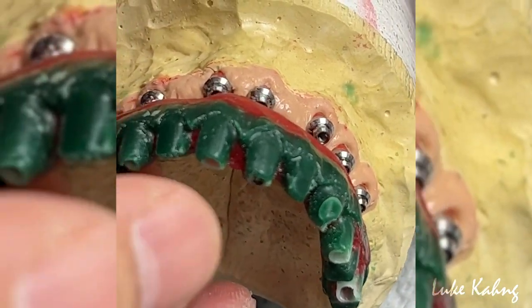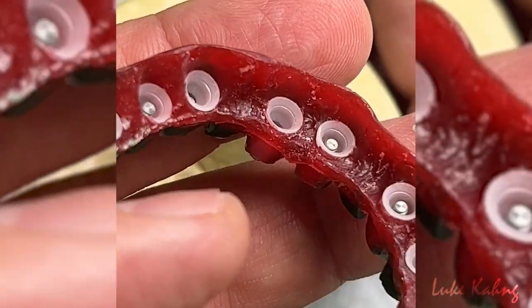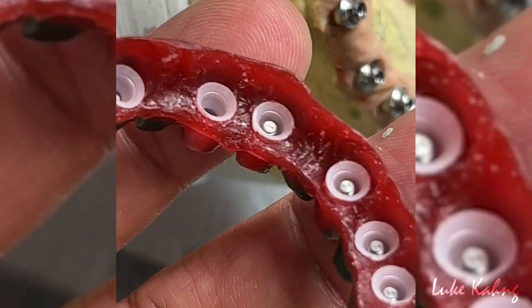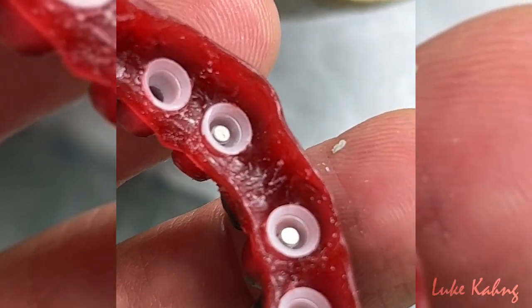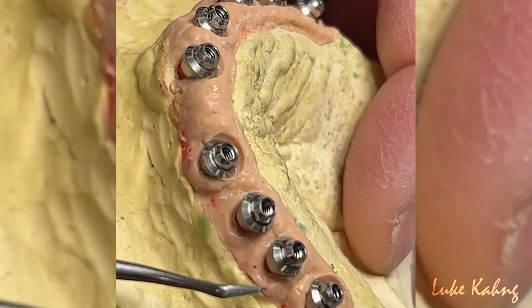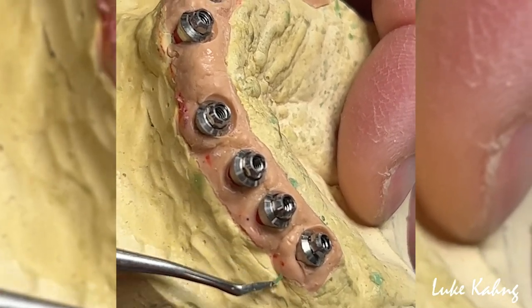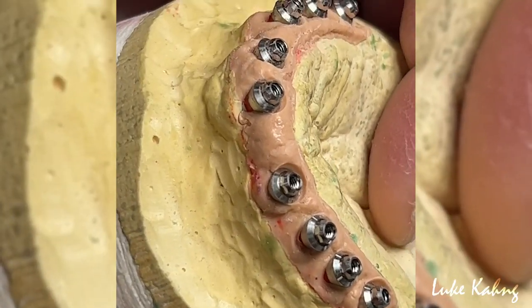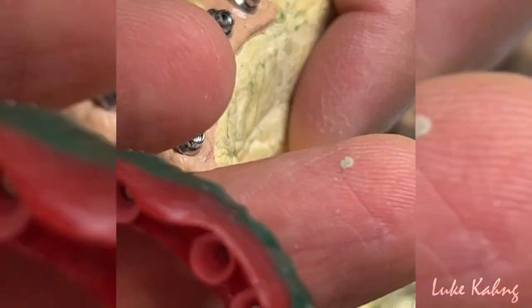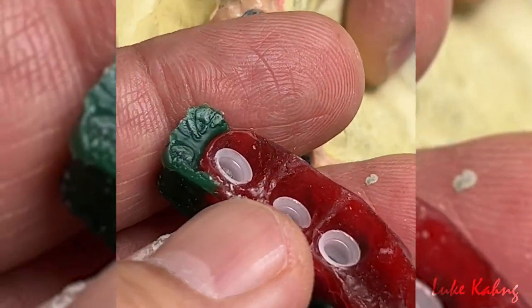This is what it looks like — we just covered the inside. Here is the issue: it's wide open. So how can we address that? You could trim a little bit more carefully to make it more even. My goal is to get a little push underneath with no bump — I want it straight, no lingering.